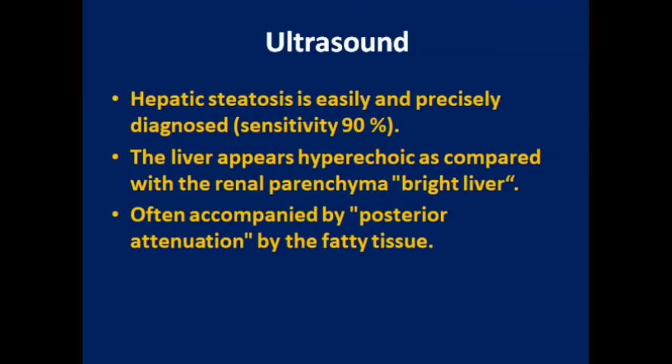Ultrasound is the modality of choice which can easily and precisely diagnose hepatic steatosis. The sensitivity is more than 90%. The liver appears hyperechoic compared to the renal parenchyma. It is accompanied by posterior attenuation due to the fatty tissue.